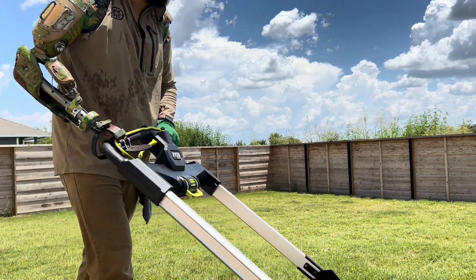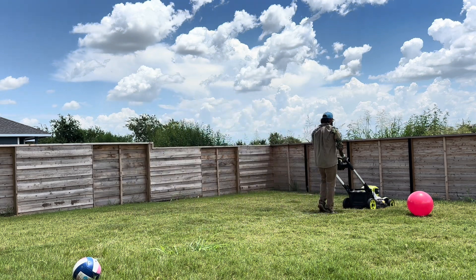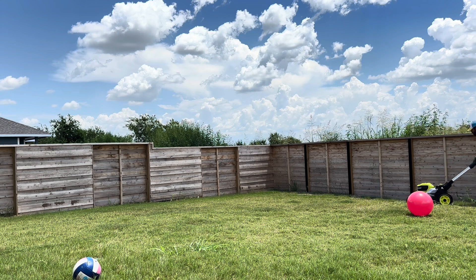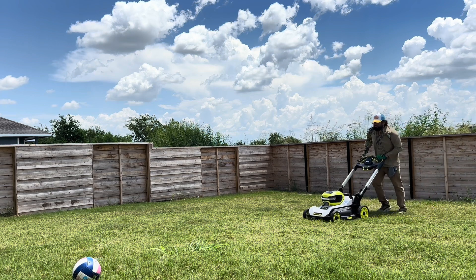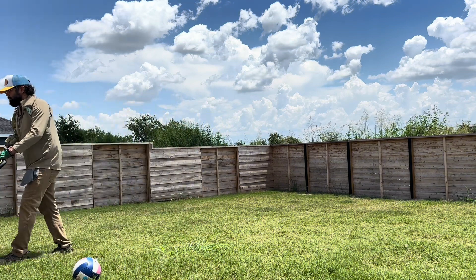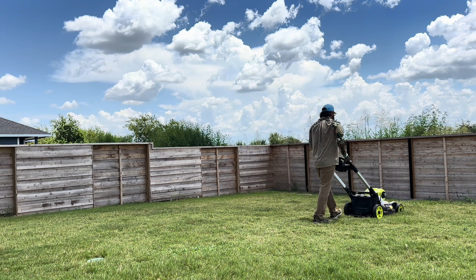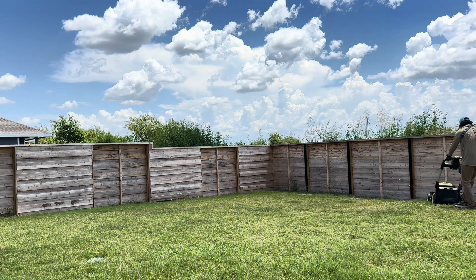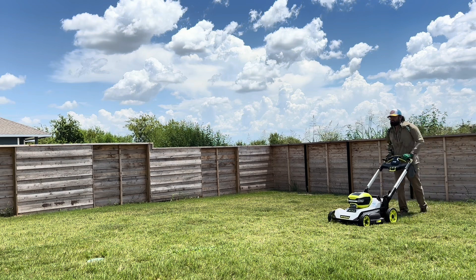If I couldn't compare it to legs, I don't know how I'd explain that upper extremity prosthetics are nowhere near the level of legs. You're seeing legs being used right now in Paris in the Olympics — mechanical running legs for above-knee amputees — and you don't see arms at that level. I know this because I've competed in things like the Warrior Games and was the only one with an elbow good enough to do certain motions, so they actually had rules against me using my prosthetic.